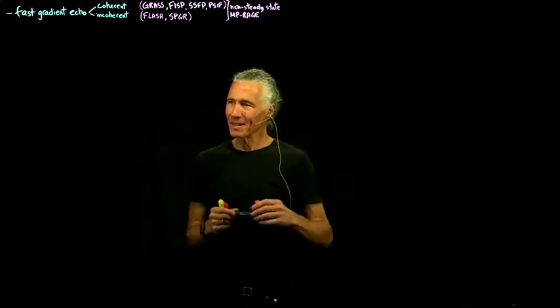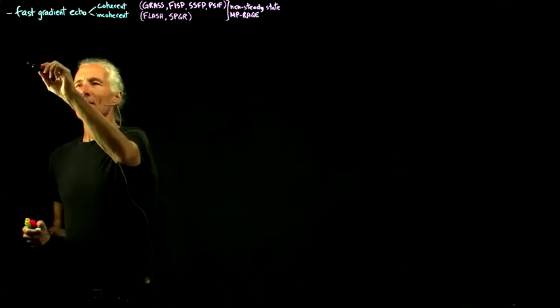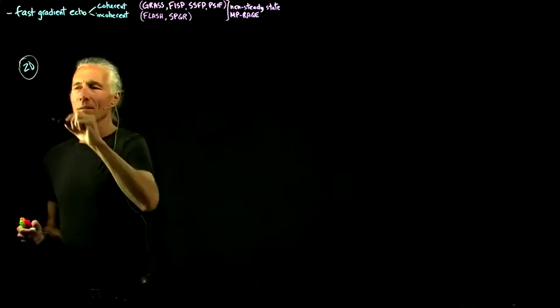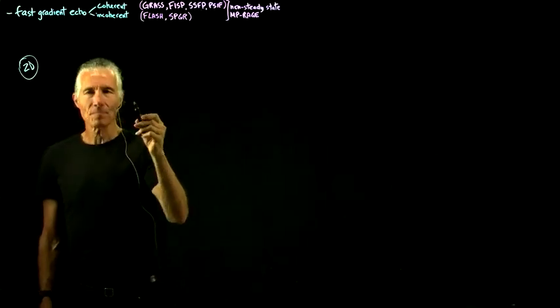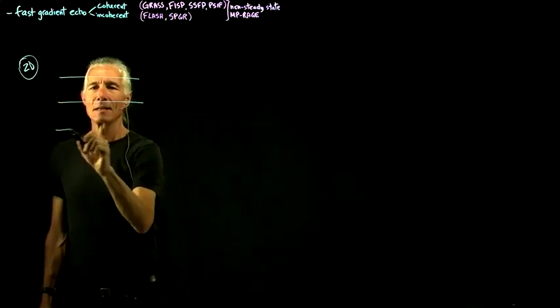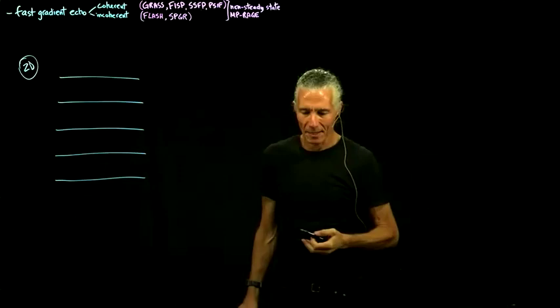So even before the coherent ones is slow gradient echoes, because remember we talked about slow spin echo. Back in the day, they started off with slow gradient echo. So this is a 2D sequence. You can do it in 3D also, but I'll just draw out a 2D one. And so slow gradient echo is basically just one pulse and record some data.